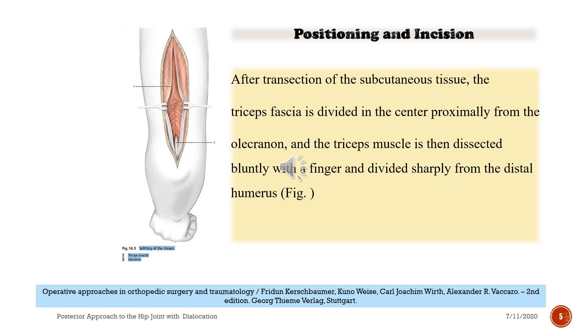After transection of the subcutaneous tissue, the triceps fascia is divided in the center proximally from the olecranon, and the triceps muscle is then dissected bluntly with a finger and divided sharply from the distal humerus.